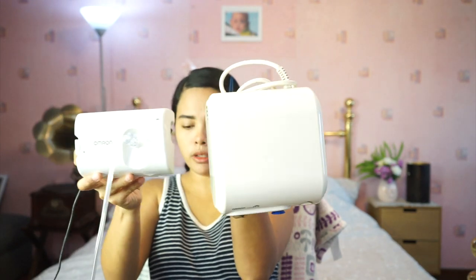This is the new one, this is the old one — obviously the old one is heavier. Now for the mist, let's try it out.